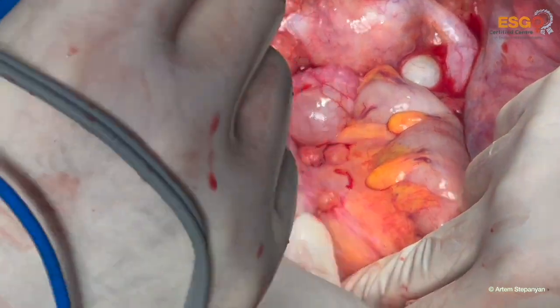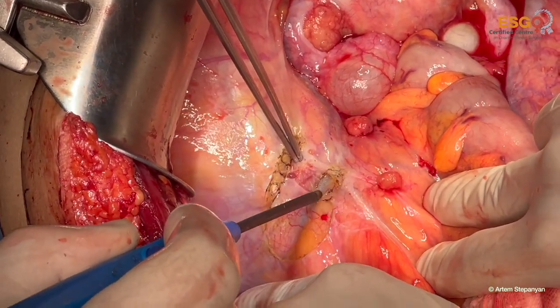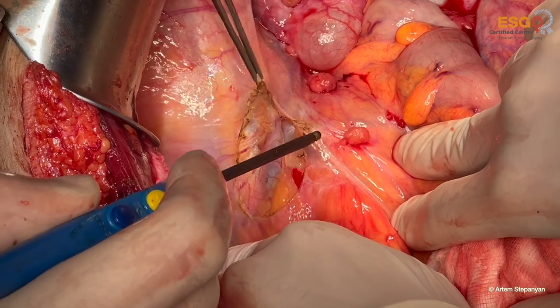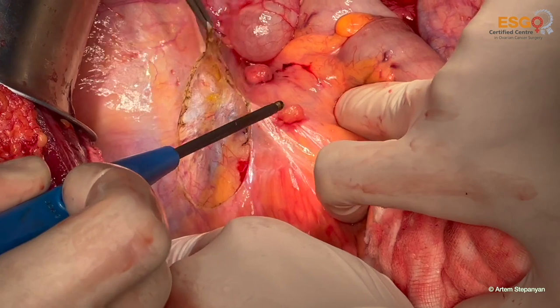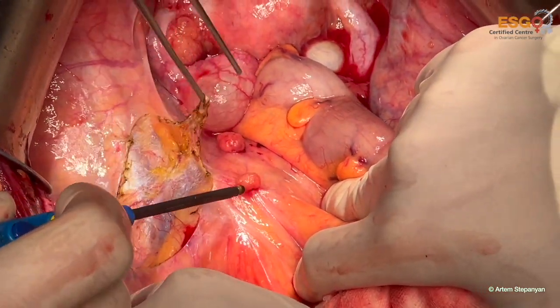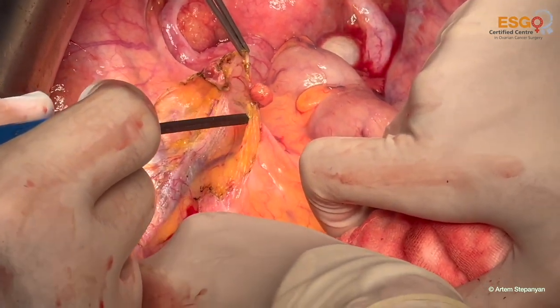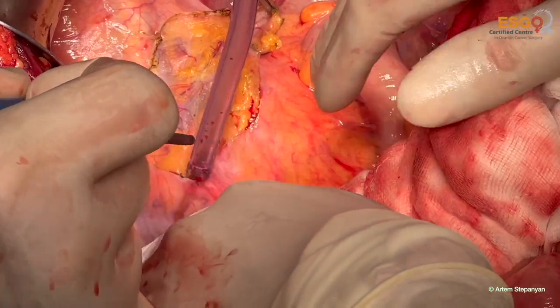So the head of the patient is on the bottom of the screen, the legs of the patient are on the top of the screen, and I'm standing on the left side of the patient. And here we see again the implants in the pelvic peritoneum. The sigmoid is retracted medially, and I take out the pelvic peritoneum.